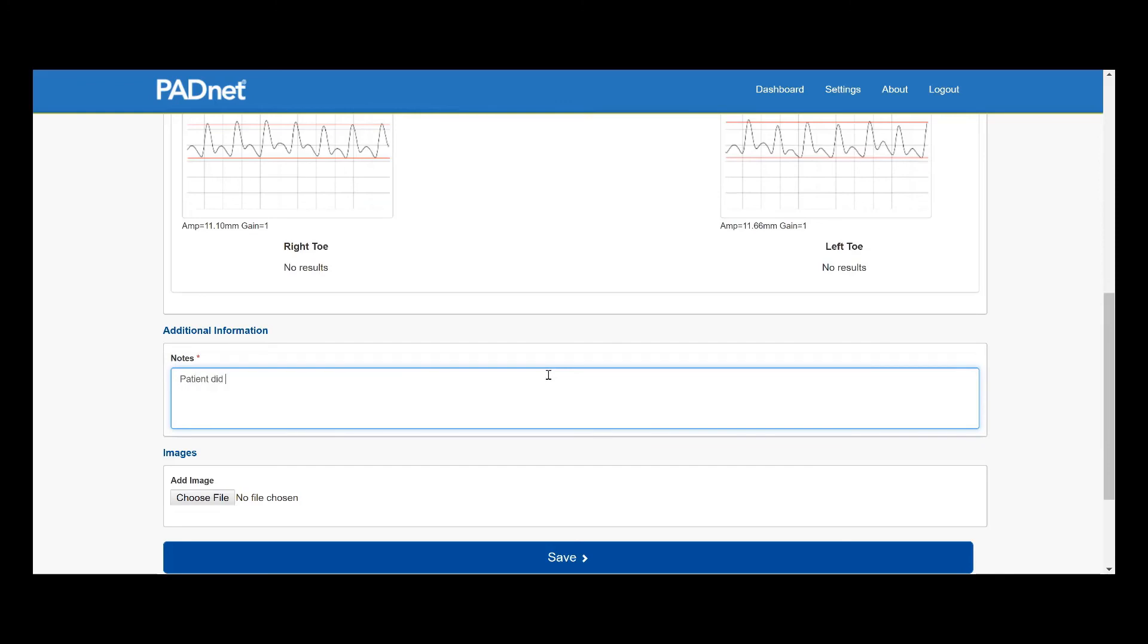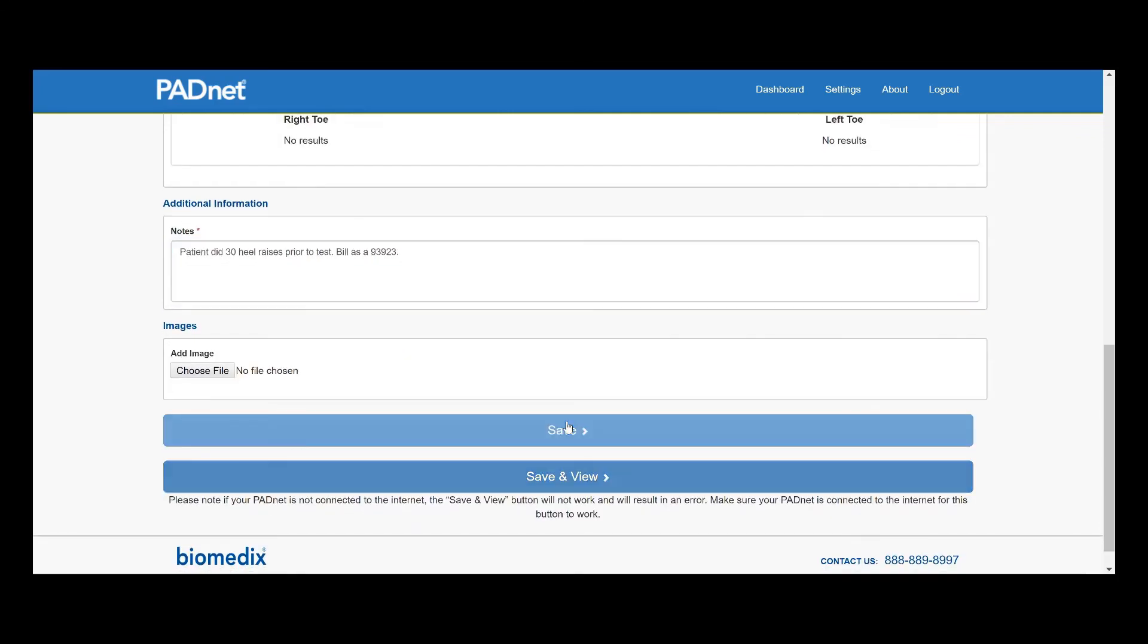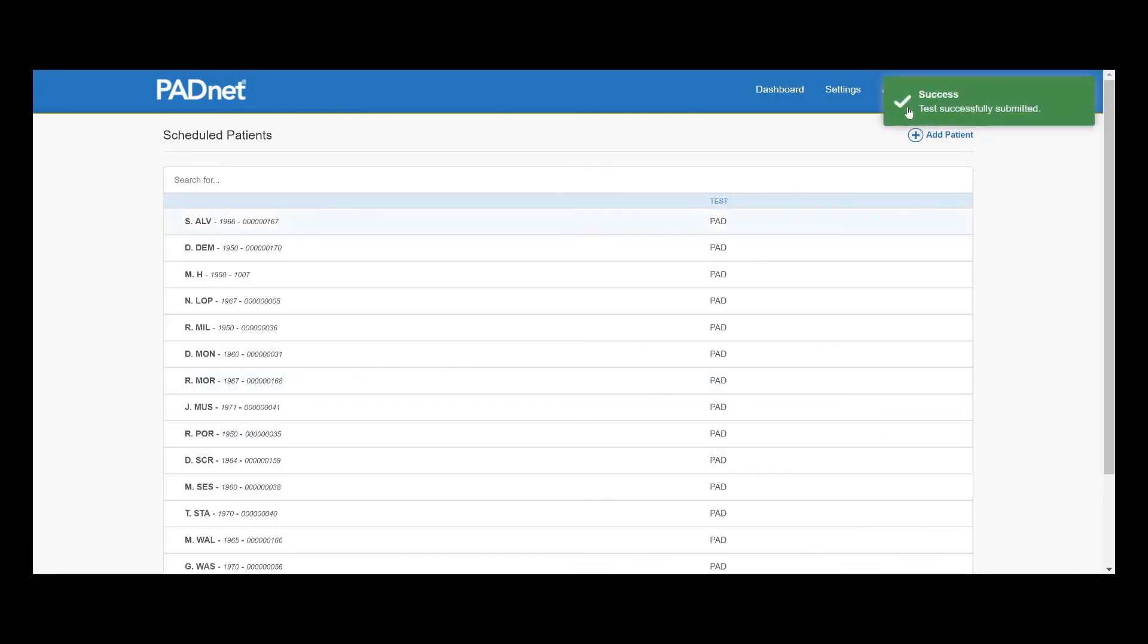Now here is what's really important. We want to make sure that we notate that our patient did 30 heel raises, because this is how we can still bill it as a 93923. I also like to include a note saying Bill as 93923 in case your office does any other screenings. It'll allow you to easily distinguish the provocative functional maneuvering tests from your screenings.